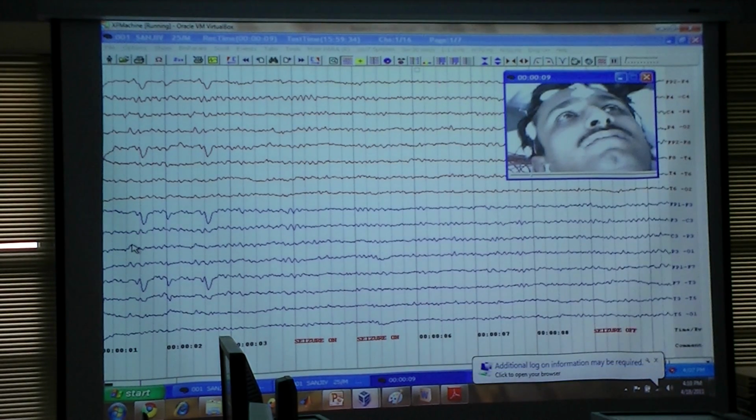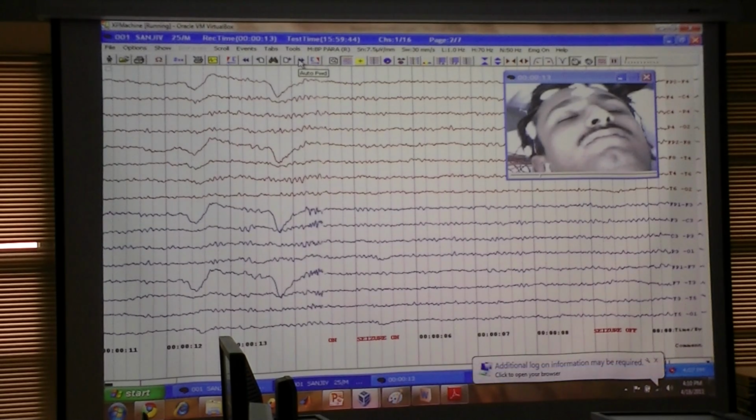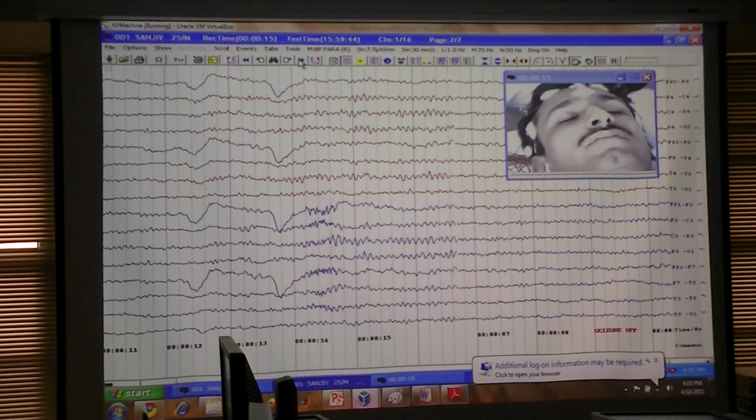Normally, you see, his eye is constant, we are getting a constant signal, okay? And just consider my video: when he closes his eyes, his signal will change, and that is a kind of signature of a single event. Look, he just closes his eyes and you can see the dip in the EEG signal.